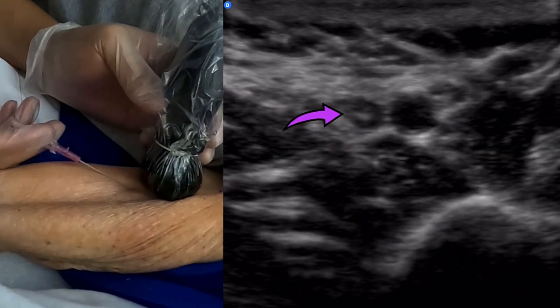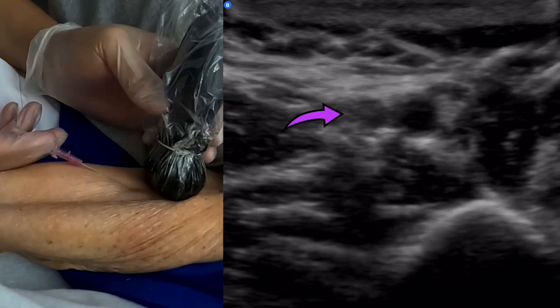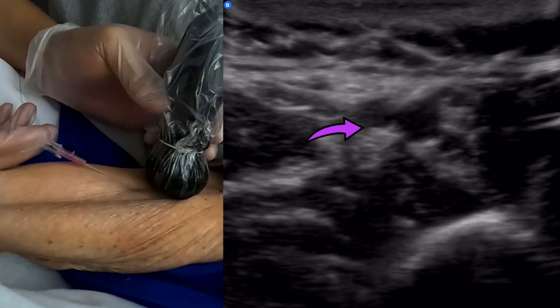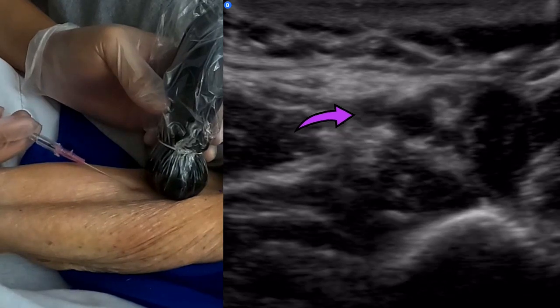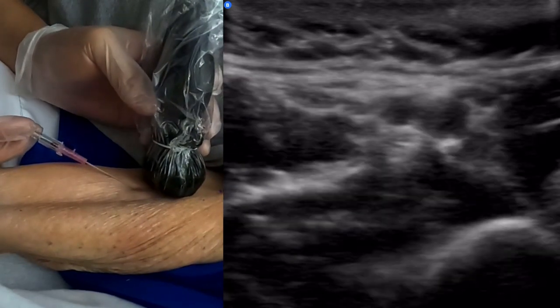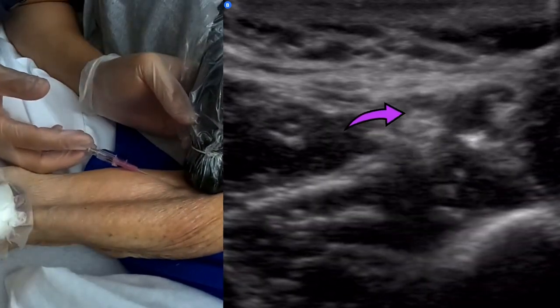So now, there's my needle tip. I'm gonna advance the probe, advance the needle, advance the probe, advance the needle, advance the probe, advance the needle, advance the probe. Ooh, there it is. There's my needle tip. Trying to find my needle tip again. There it is.